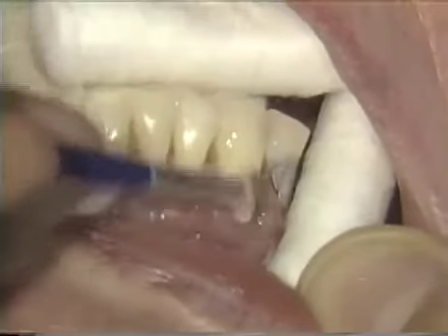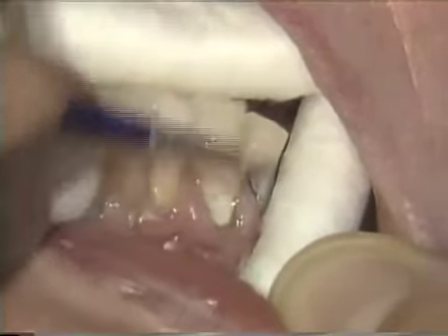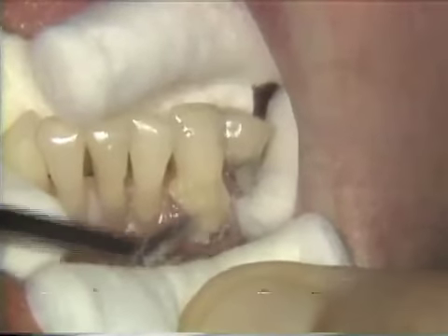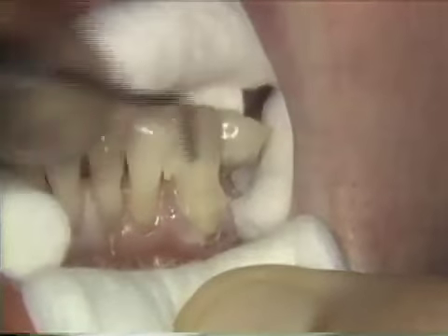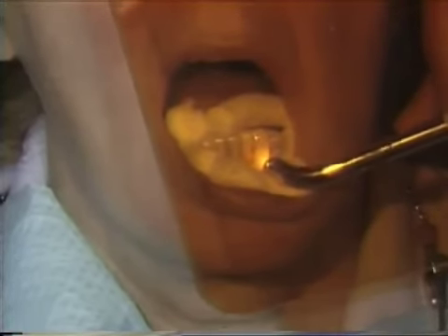A dentinal bonding agent is applied in 2 thin coats and light cured for 10 seconds. Eye protection is used. The dark yellow shade of composite is layered by hand from cervical to incisal and contoured close to the final at the cervical, while at the incisal, room is left to permit placing of the next composite layer. The dark yellow composite is light cured for 30 seconds.